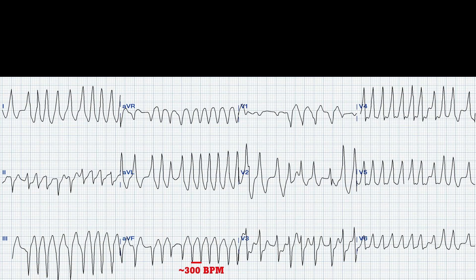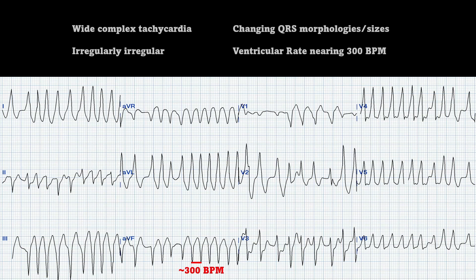So it's an irregularly irregular wide complex tachycardia — it's over a rate of 100, so it's tachycardic. Normally when you hear wide complex tachycardias, you instantly think of ventricular tachycardia, but those are regular. This is actually going to be AFib with Wolf-Parkinson-White syndrome, or AFib with pre-excitation. You're going to have a wide complex tachycardia, which we do have here. It's going to be irregularly irregular, which we do have in V1, V2, and V3. You can see the QRSs are occurring erratically. You can also notice changing QRS morphologies and sizes.